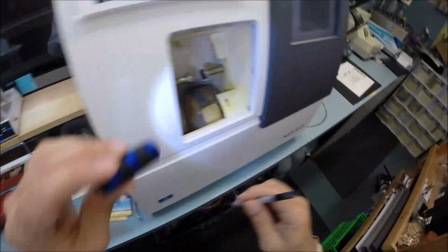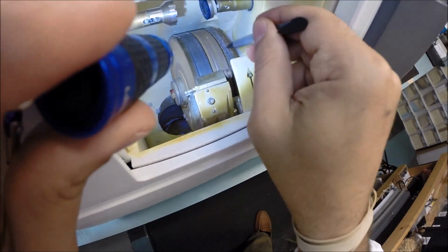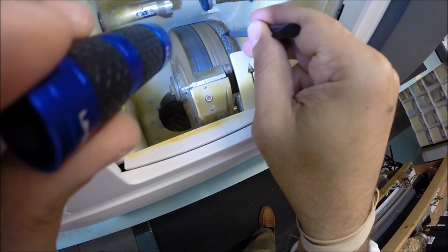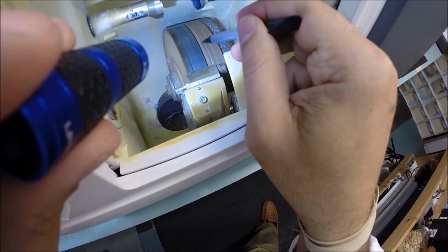Where's the stylus? The cutting wheel, the dirty cutting wheel. You think I could have washed this a little better, since I knew I was going to have company coming over. That's the grinding wheel that's going to grind the lens down into the final size. This wheel in the center is what's going to put the bevel onto the lens so it stays inside the bevel of the frame. If it doesn't stay, we'll just tape it.